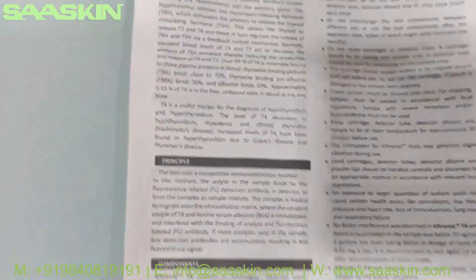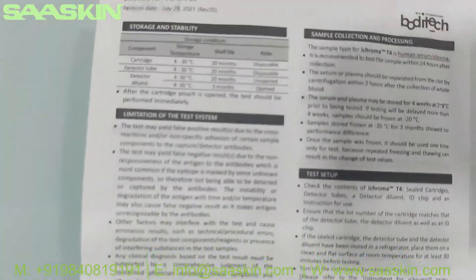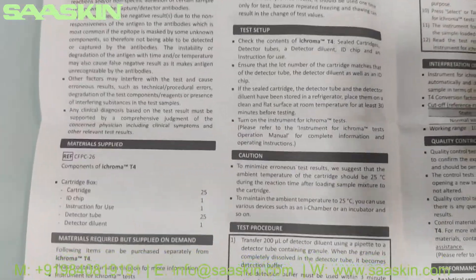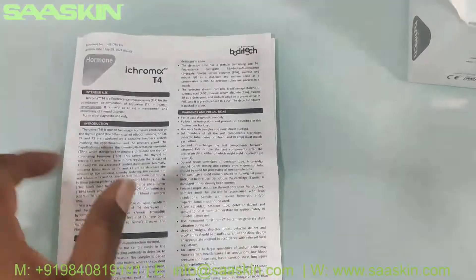The insert provides the introduction, the principles, the key components, and also the setup procedures — including limitations of the test, how to set up and conduct the test, and how to interpret the results. The complete procedure is available in the insert.